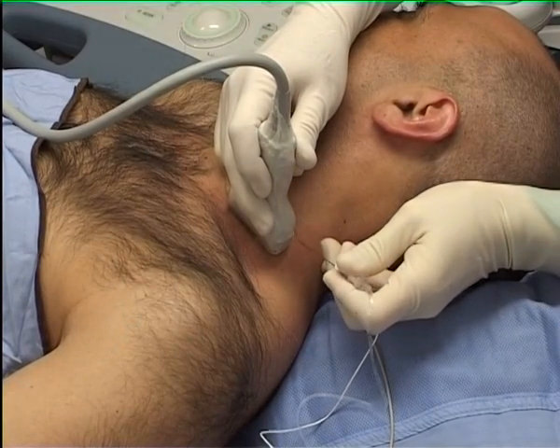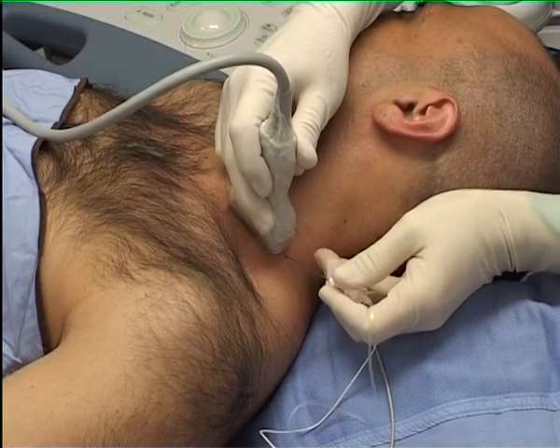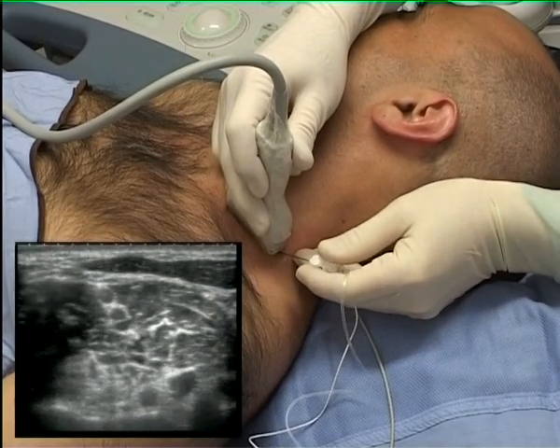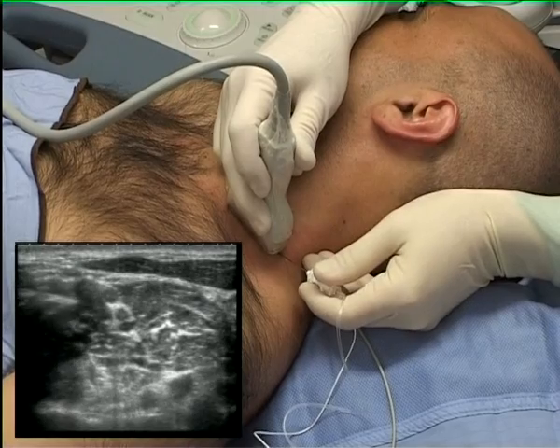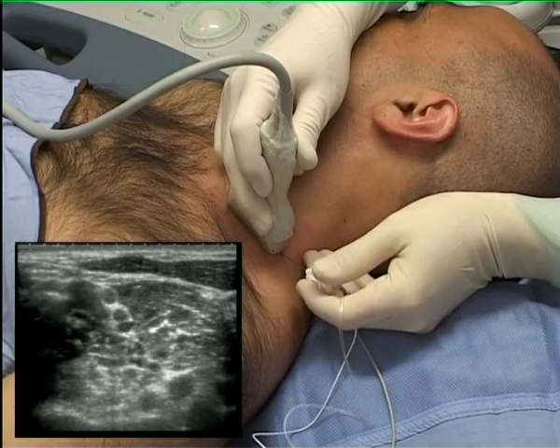Note how in this sequence the needling hand also rests on the patient's neck to allow precise needle tip control. Small adjustments of probe angle and needle position ensure good visibility of the needle tip in the ultrasound image.